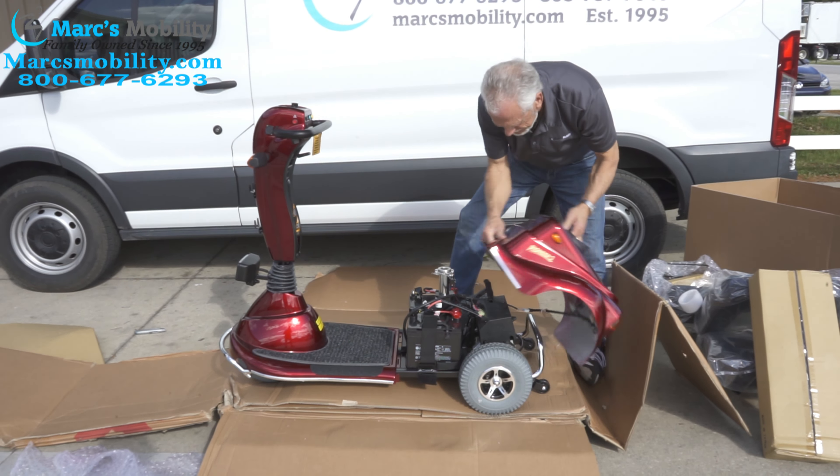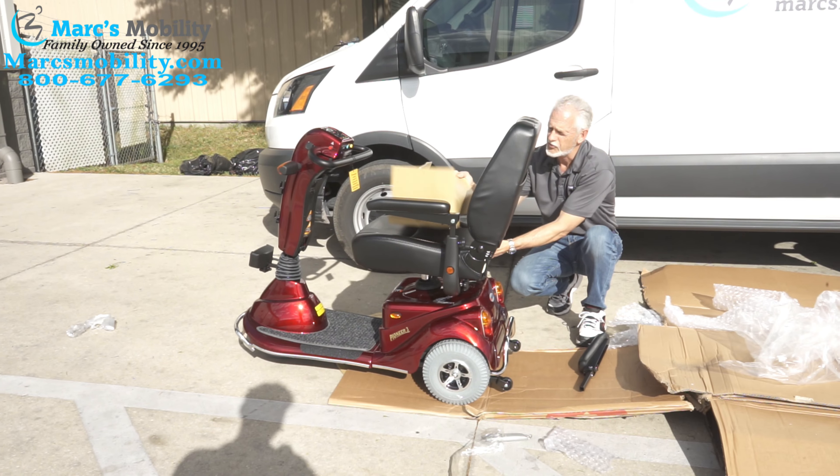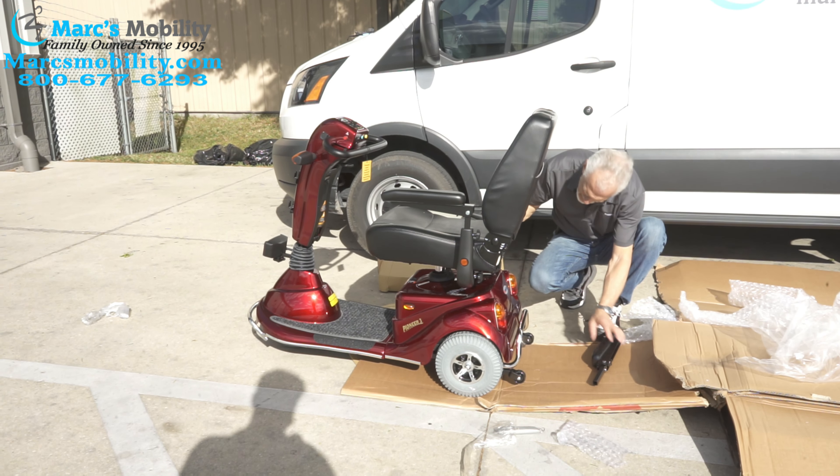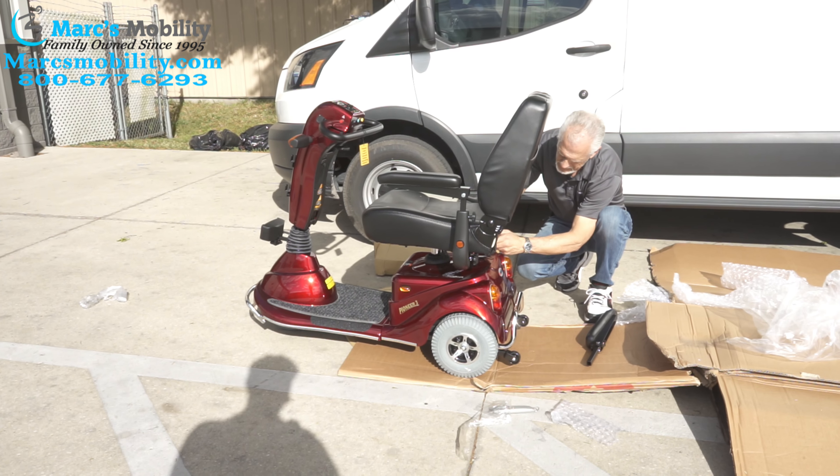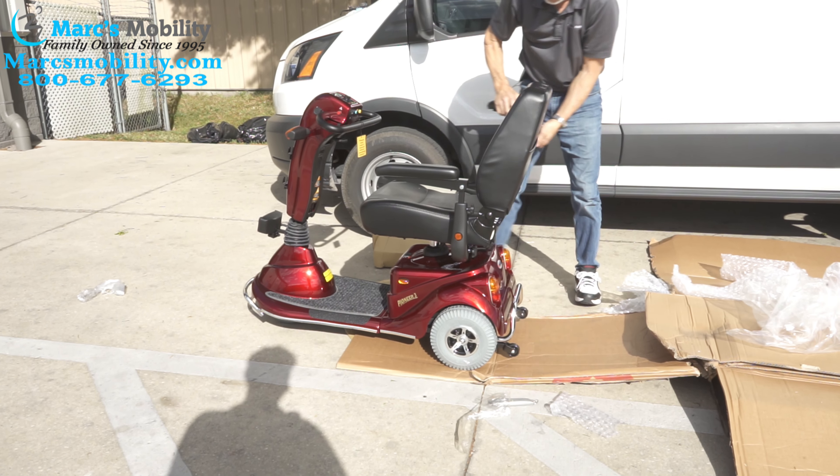I'm going to do the other arm — it will be the same thing on the other side. Just make sure you don't lose any pieces. Look in your box — on this one the knob is already on the arm, but the other one was loose in the box. Make sure your little knobs right here, you don't lose them. I have people calling me back because they unboxed their scooter and lost half their parts because they weren't paying attention. Tighten it up and put this one in like we did on the other side. Your owner's manual is inside the box with the arms.